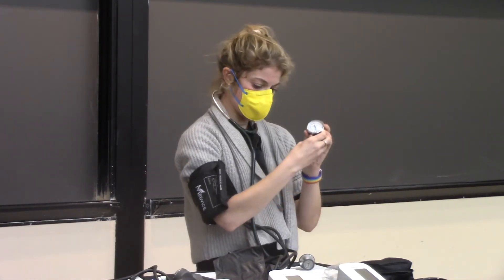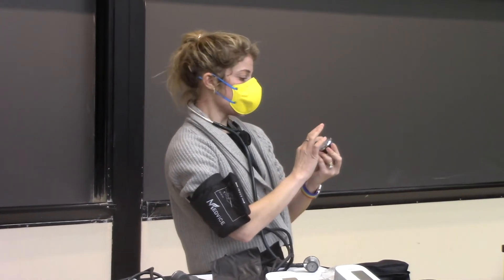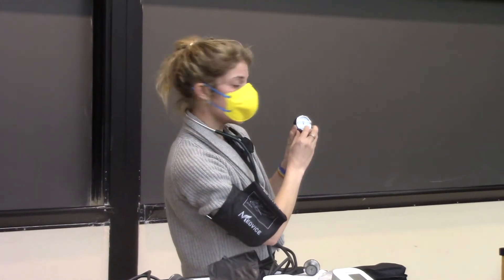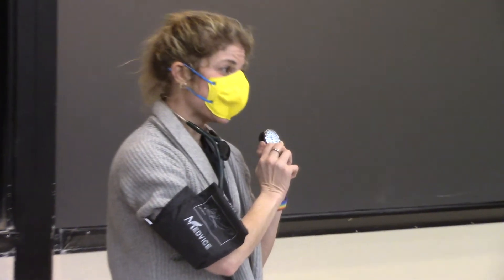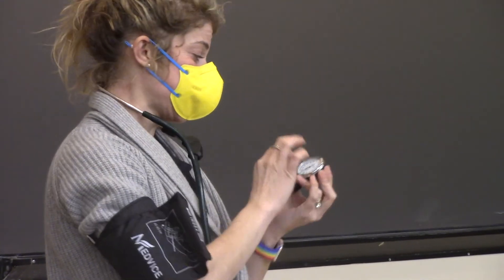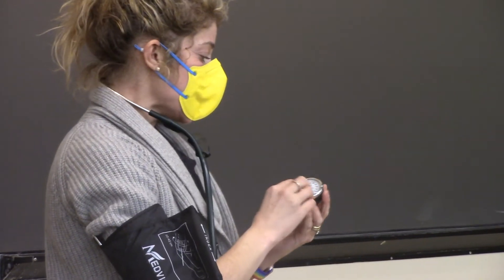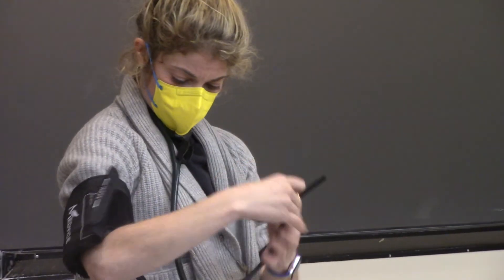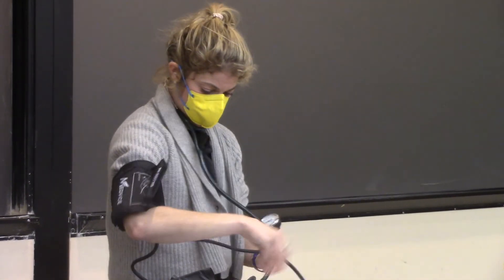This is measured in millimeters of mercury. What's important is that it goes from 20 to 300. Hopefully you'll never have somebody with blood pressure of 300 — if you do, just call 911. And you won't have anybody with a blood pressure less than 20, because that's the same situation. Usually the gauge will be all set for you.